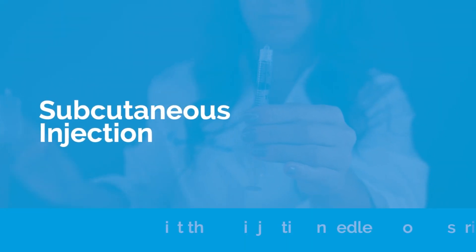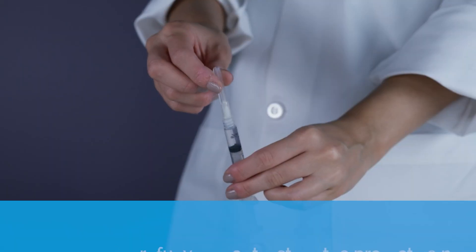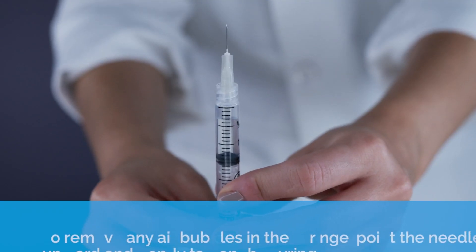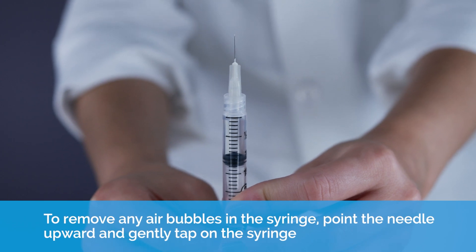Subcutaneous injection. Twist the administration needle onto the syringe. Carefully pull or twist off the protective needle cap. To remove any air bubbles in the syringe, point the needle upward and gently tap on the syringe.